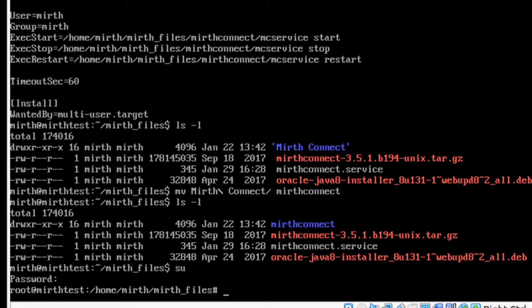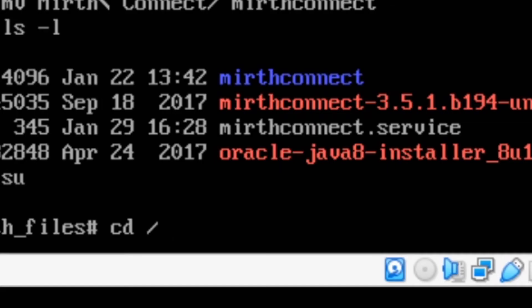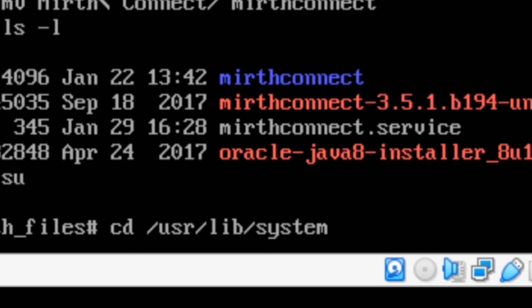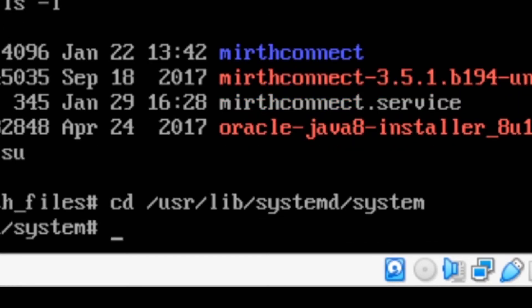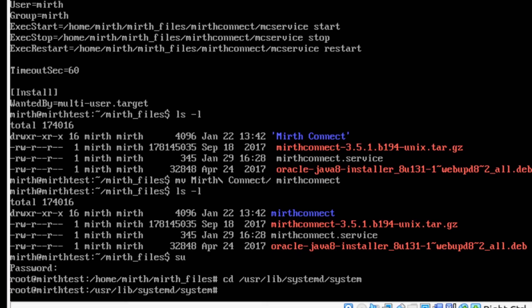Now we want to go ahead and change directories into our target directory. So we want to do cd /usr/lib/systemd/system. This will take us to the main directory for systemd that has all of the startup stuff for Linux.